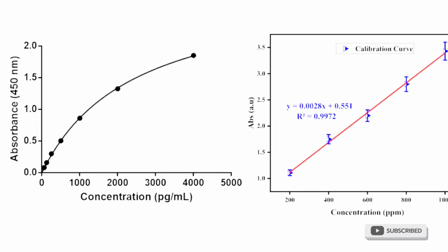So maybe 0.999, like as you can see here, or 0.98 as the case may be. But you really want it to be as close to 1 as possible. So this is what we mean by linearity. This is also what we mean by linearity.